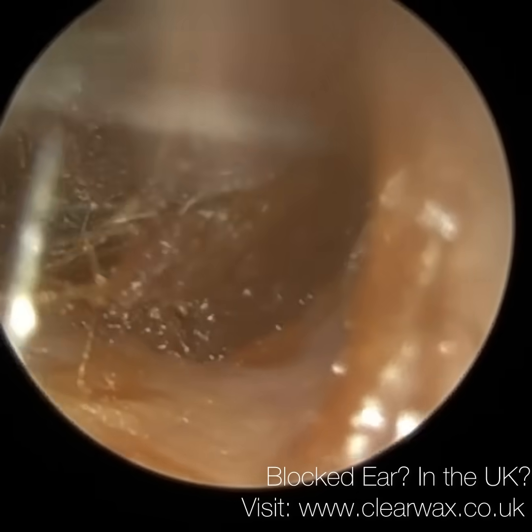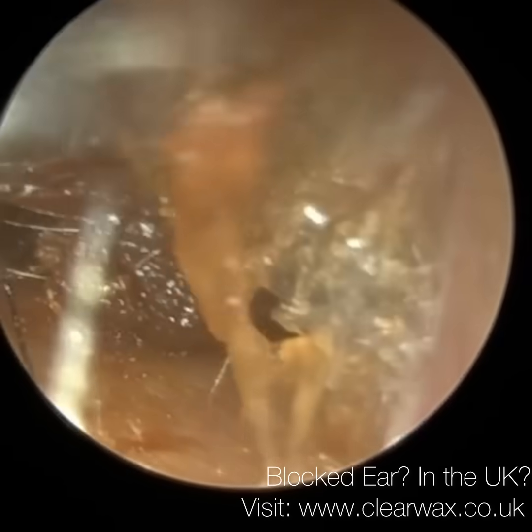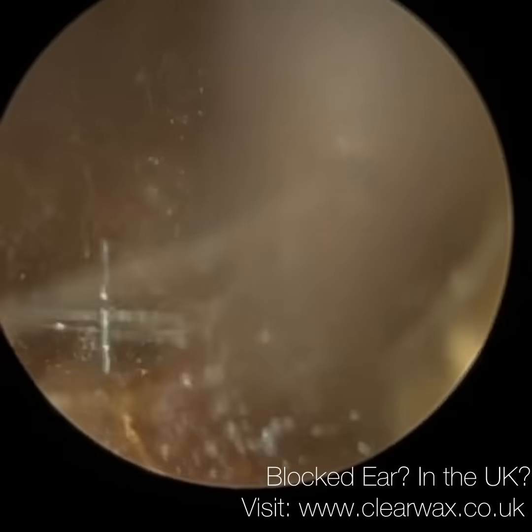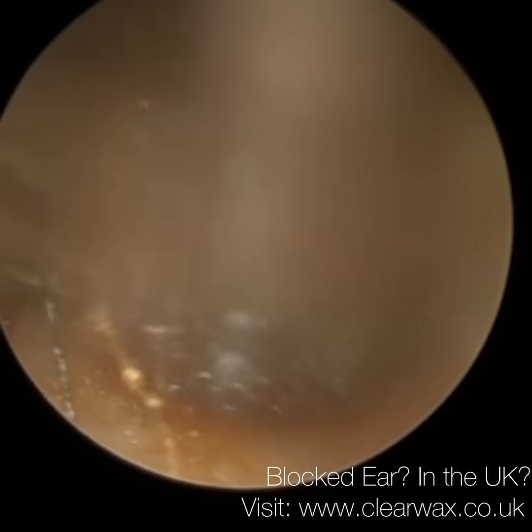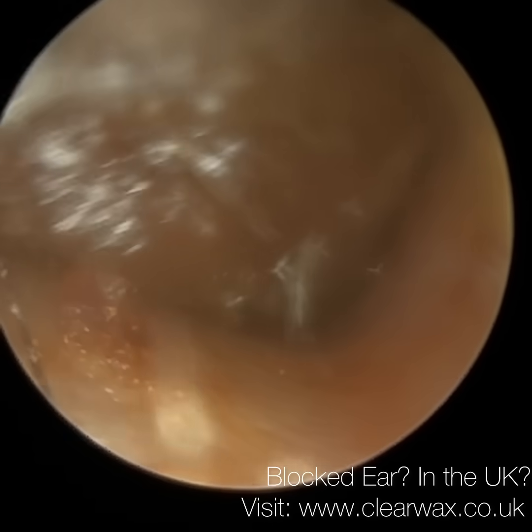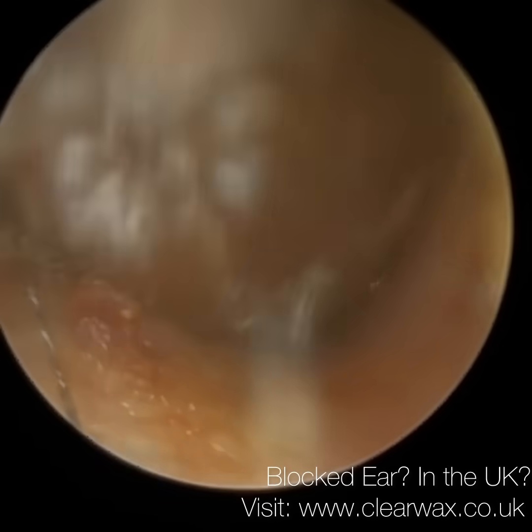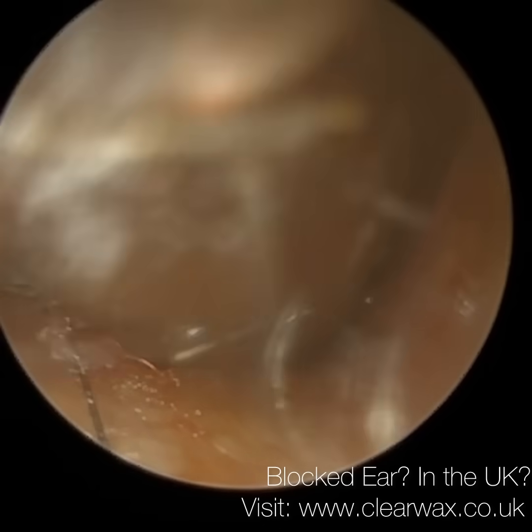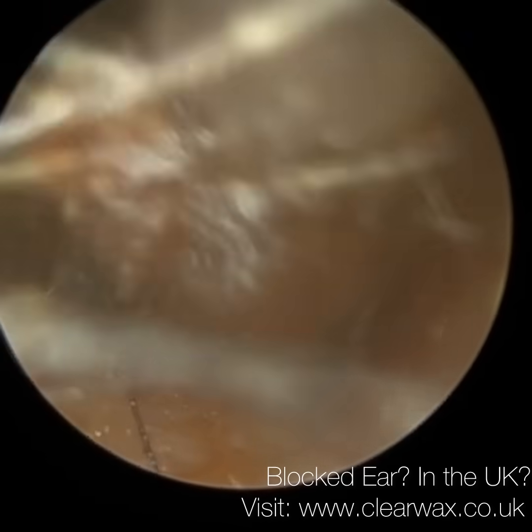When you're using an endoscope, we are using it not only to visualize the earwax, but we're also using the side of the endoscope to stretch open the ear. So where these hairs are, the first bend, in the case of this patient's right ear, I'm using the left-hand side of the endoscope almost like a door stopper.